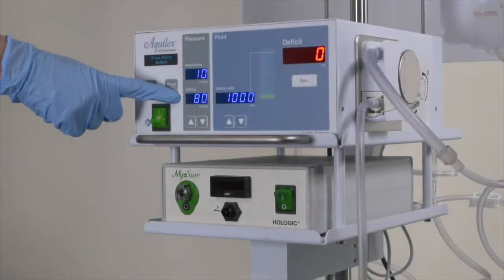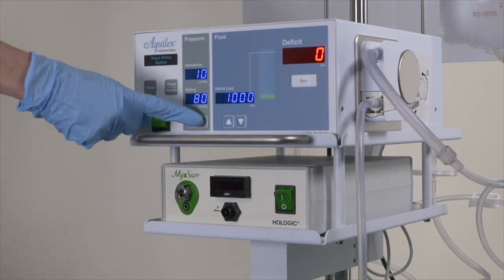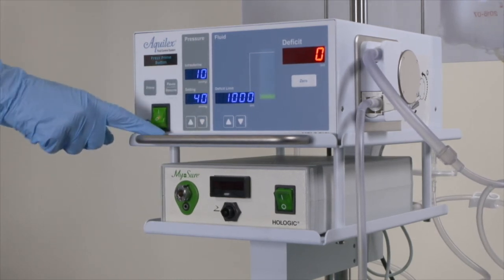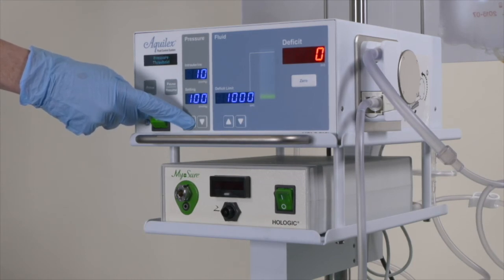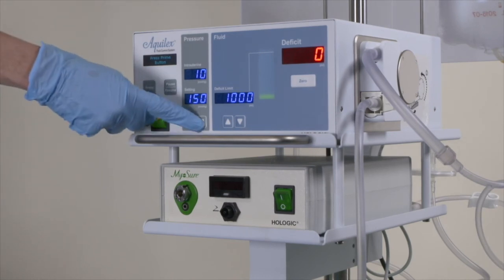Pressure will default to 80 millimeters of mercury. Use the arrow buttons to increase or decrease the intrauterine pressure during the procedure at the consultant's request. The minimum pressure setting can be set to 40 millimeters of mercury and adjusted up to 150 millimeters of mercury. Once a safety threshold of 100 millimeters of mercury is reached, an audible warning sound is emitted. Release the button for 1 second and scroll again to set higher values up to 150 millimeters of mercury.